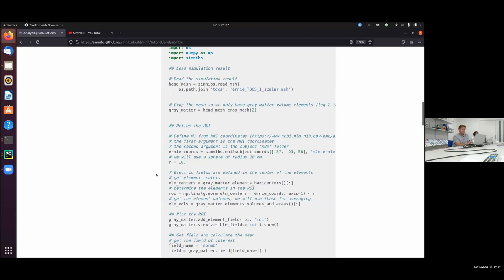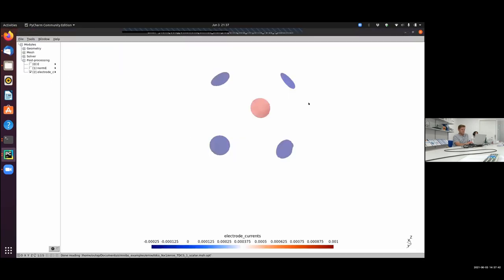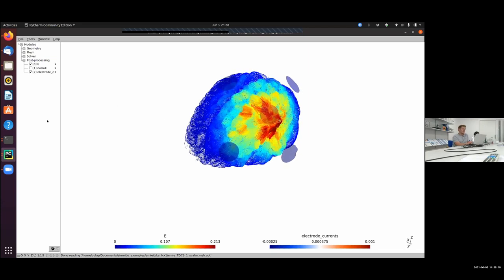These two options exist. Now, your second question is interesting, also from a scientific point of view, namely, does the E field differ depending on the TMS parameter? Obviously, when you change TMS parameters of a repetitive TMS protocol, the outcome changes wildly, but this is not what SimNIBS captures. SimNIBS just gives a snapshot of the electric field which our TMS coil induces, usually at the time point when it's strongest. So this is a very restricted amount of information, which is already useful, but then you have to look into how this electric field acts on the neurons and activates them, and then, I guess that's why you're asking for rTMS, inside the neural network, induces neuroplastic effects.